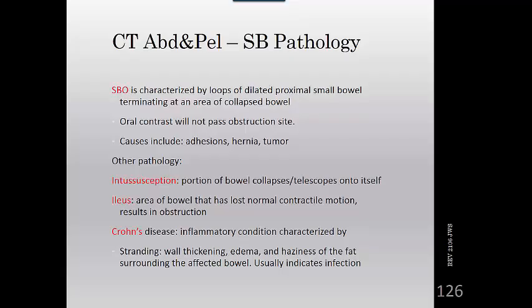Crohn's disease is an inflammatory condition characterized by stranding, wall thickening, which is wall thickening or edema, and haziness of the fat surrounding the affected bowel. I'll point that out in some images. And it usually indicates an infection.